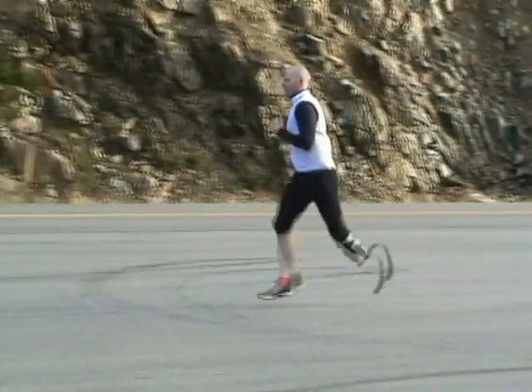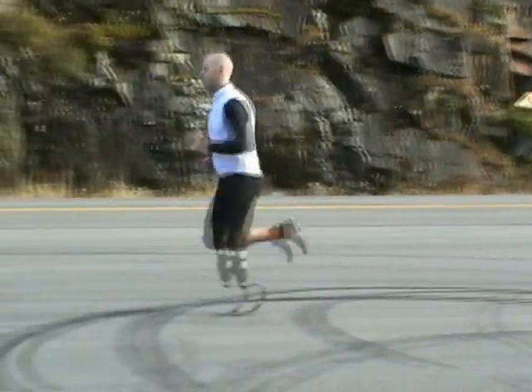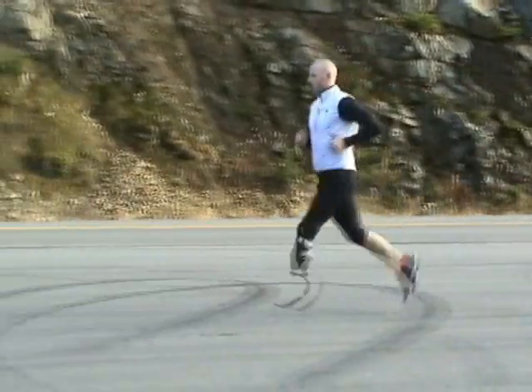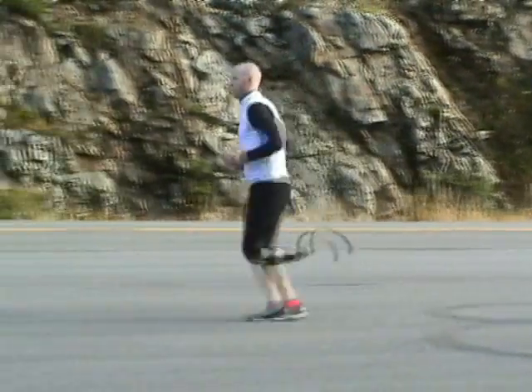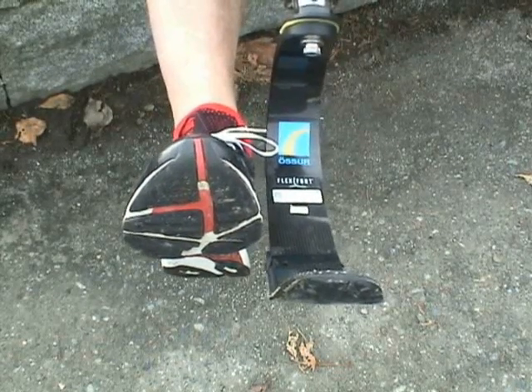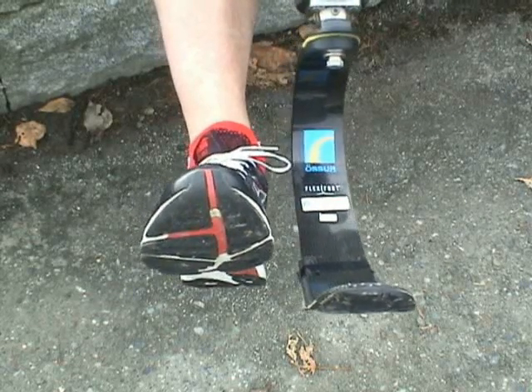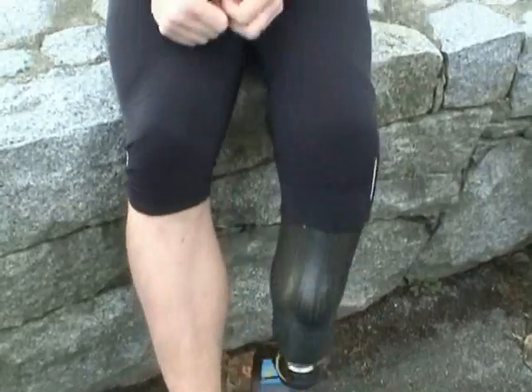One of the interesting things about the running leg, and one of the things that took a lot of adjustment between my prosthetist and me, was getting the height of the leg appropriate. When you run, obviously the shape compresses, so it needs to start out longer than your other leg, so that it compresses just enough that hopefully you're not bouncing along the road. If you look down at your running leg and your other leg fully extended, you should see maybe 2 inches of difference. In my case, with my weight and the category of that leg, 2 inches was right. But that is a measurement your prosthetist is going to have to work on a fair amount to get right, so that you can run appropriately.